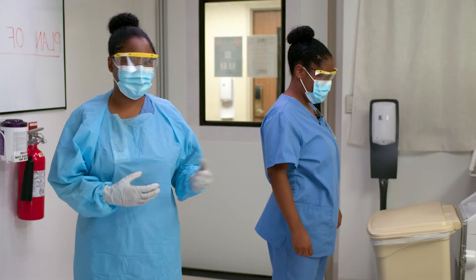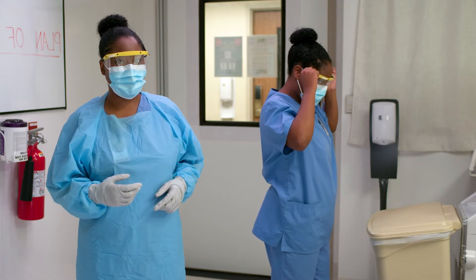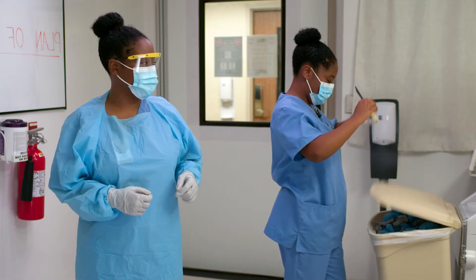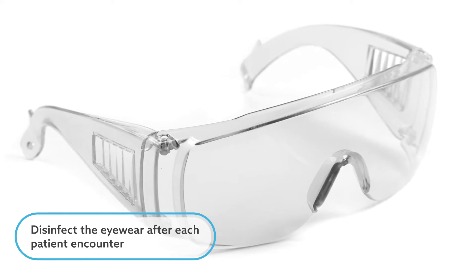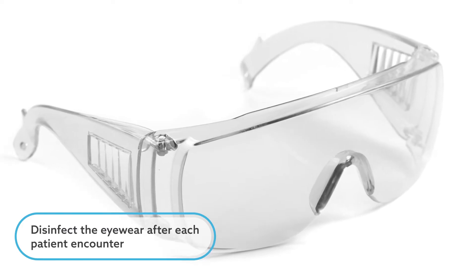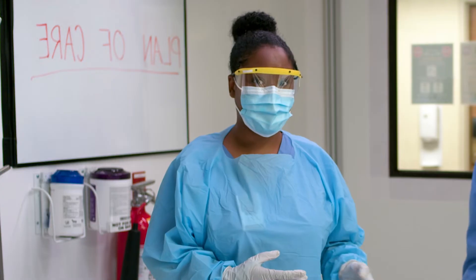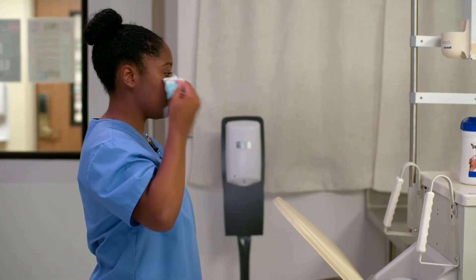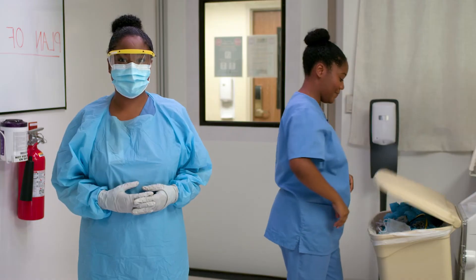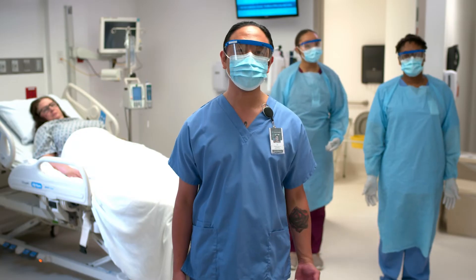Next, if you're wearing single-use eye protection, remove and dispose. If you're using reusable eye protection, disinfect the eyewear after each patient encounter in accordance with the manufacturer's instructions. Last, remove the mask. Grasp the ear loops, lift over the ears, and discard into a waste container. When you're finished, perform hand hygiene.